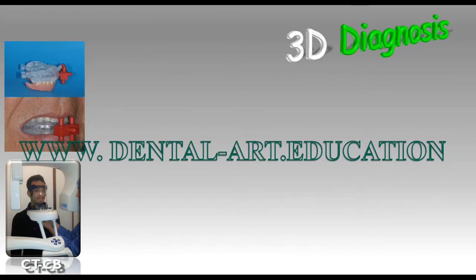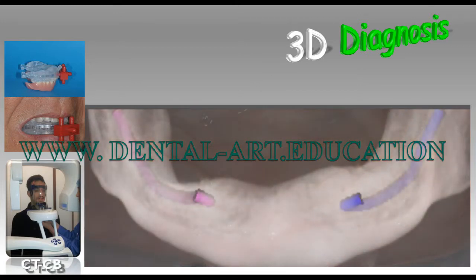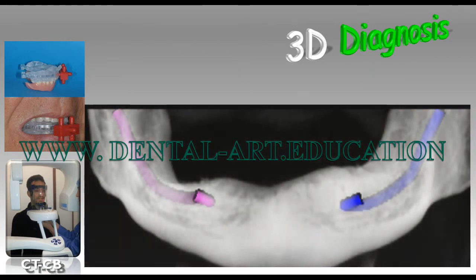I will show you the basic workflow. The first step of the protocol is the preparation of an appropriate guide for the CT/CBCT scan, able to support a 3D marker. So far, in this edentulous lower jaw, we can see clearly the anatomy of the bone and the position of the nerves.